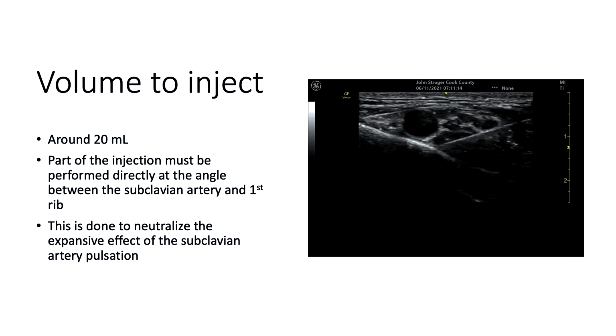But in the era of ultrasound it would be a disservice to the image if you just waited until you got there, since you can hydrodissect your way into where you want to go, and in the process you are using some of the local anesthetic, making your life easier, moving nerves away from the tip of the needle, and eventually keeping in mind that part of that volume, which, you know, we used to inject 40, but the new 40 is 20, will go into that corner, and that you will not rest until local anesthetic occupies the corner instead of a nerve occupying that corner.